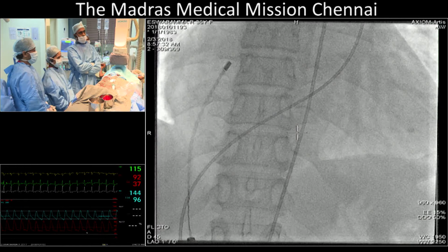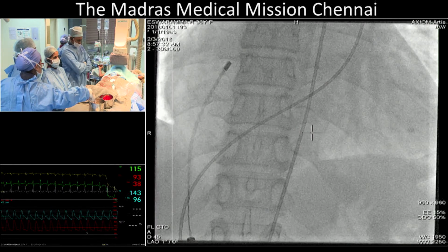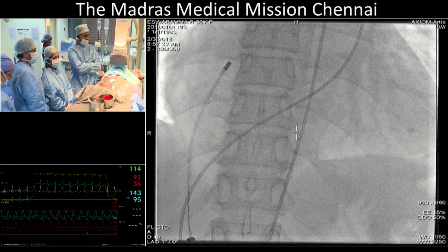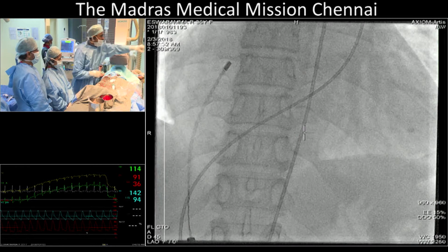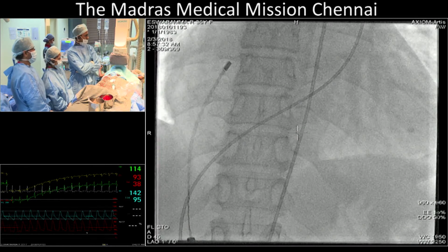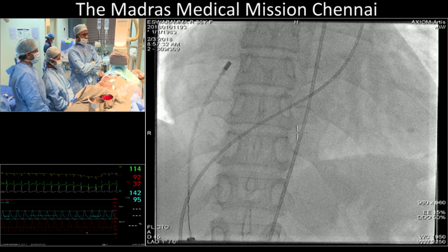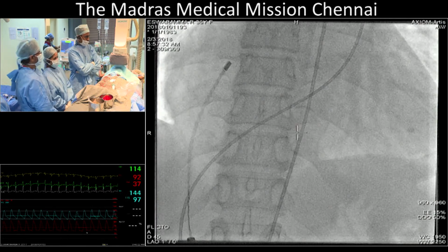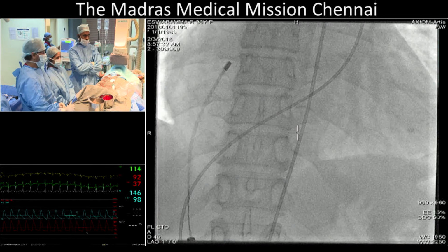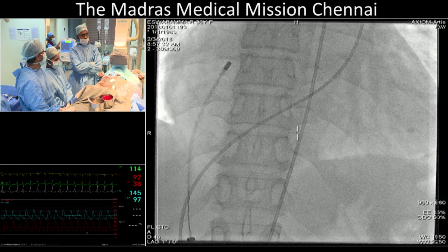There's the pulmonary artery pressure. What do you do? 92, 37, 56. Again, what will you do now? He's showing the pulmonary artery pressure in oxygen. In oxygen, I would never use oxygen for testing a patient with a shunt, because all calculations are wrong afterwards. So I would look, as Barrett has mentioned, to the diastolic pressure gradient, which is 0.4. Thus, the patient has a reactivity of the pulmonary artery system. I can see it by the numbers.